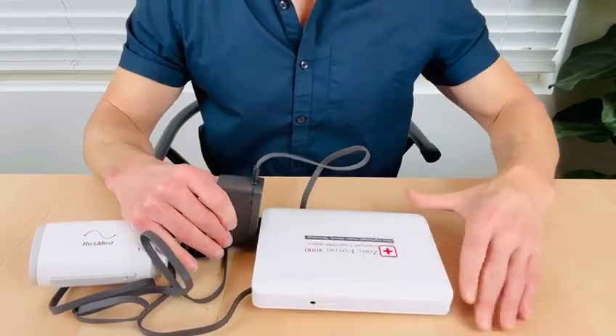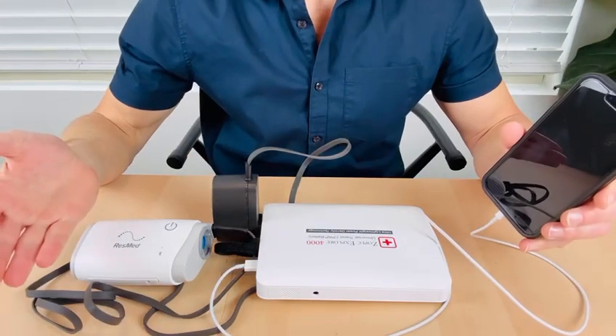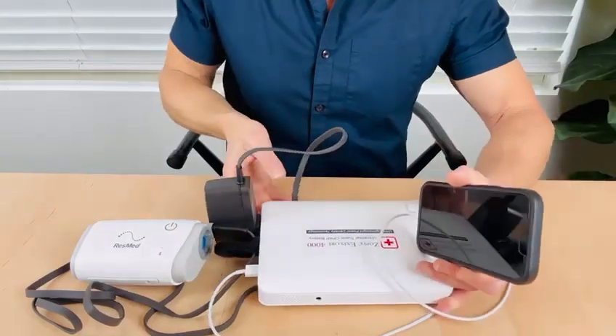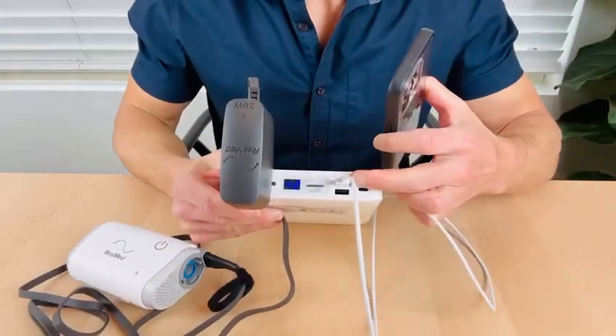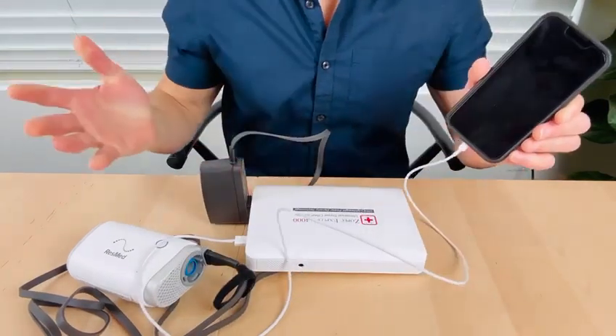The device will now have power. That's all there is to it — no extra cables or adapters needed. Additional features include fast charging USB ports and USB-C for all of your daily gadgets such as cell phones, laptops, and cameras.